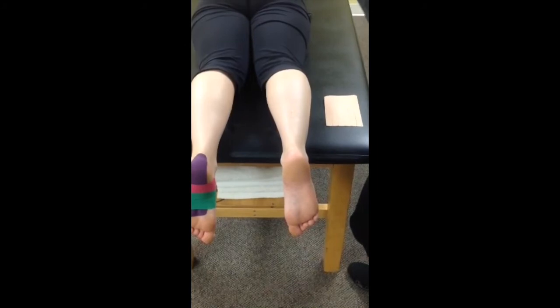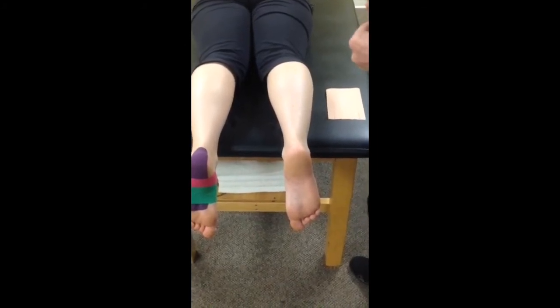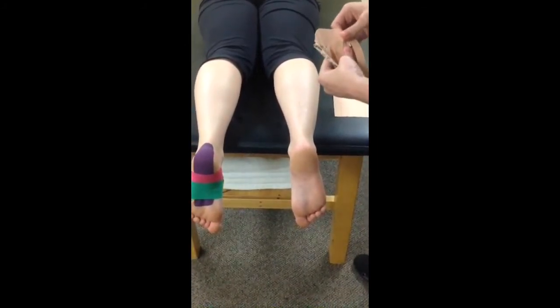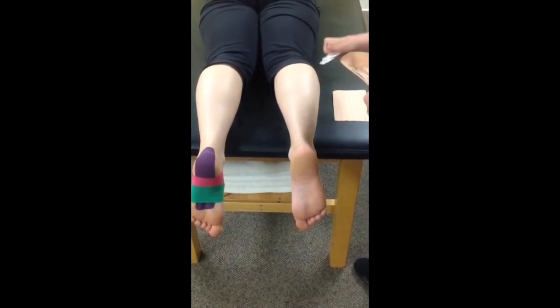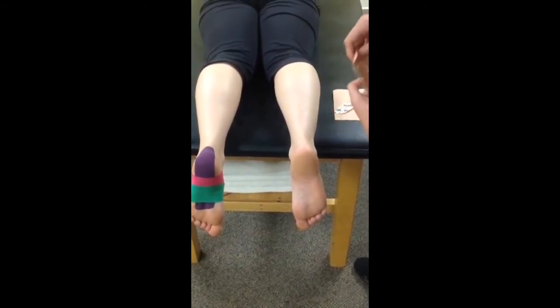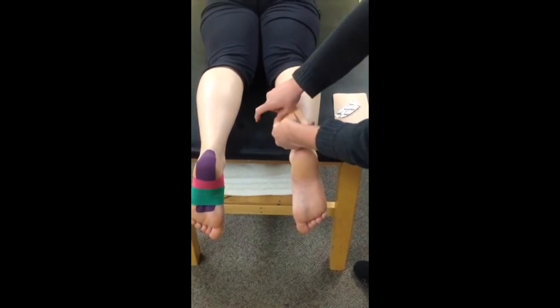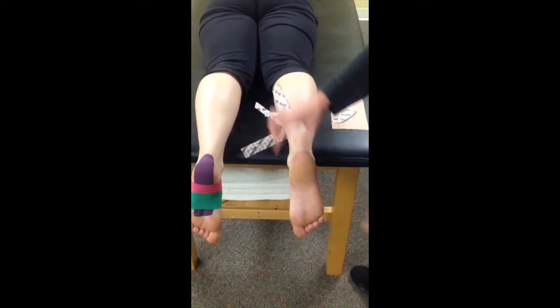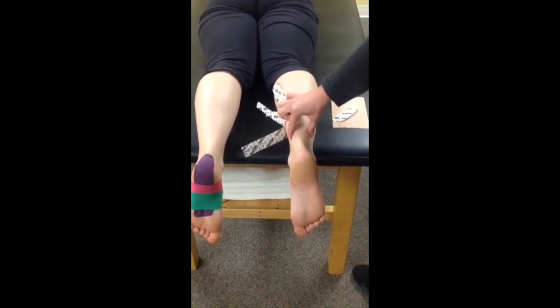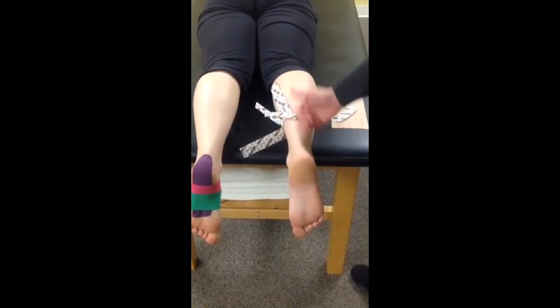So what we're going to do is rip the ends of the tape and I'm going to anchor it. So if she had swelling here at the back of the ankle, this is where I put the tape.